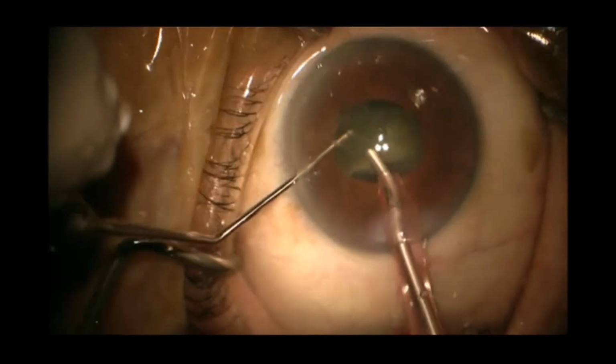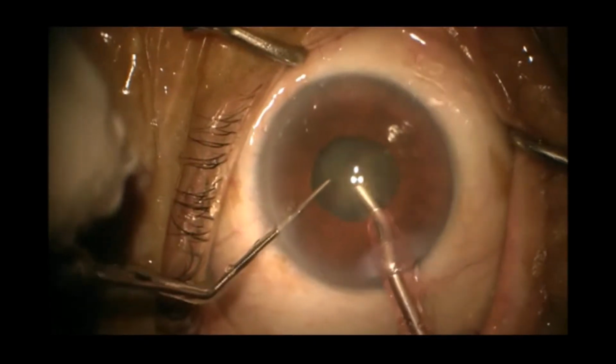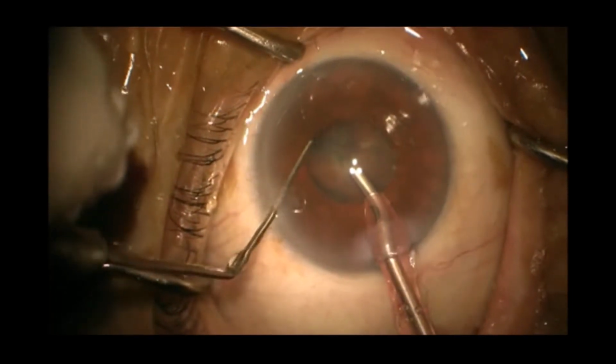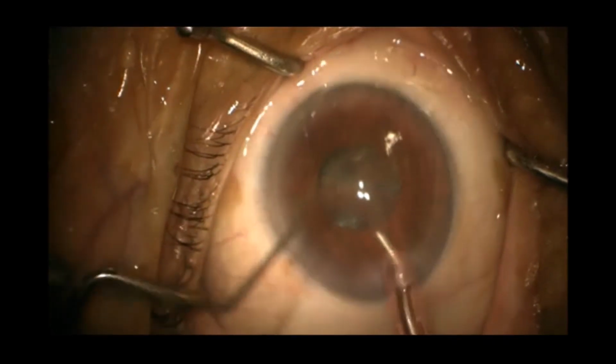It's very important to be slow. We don't want any turbulence in the anterior chamber. We have a small pupil, inadequate view of capsule. We don't know how big our rhexis is, so we have to be very slow and controlled in the whole surgery.